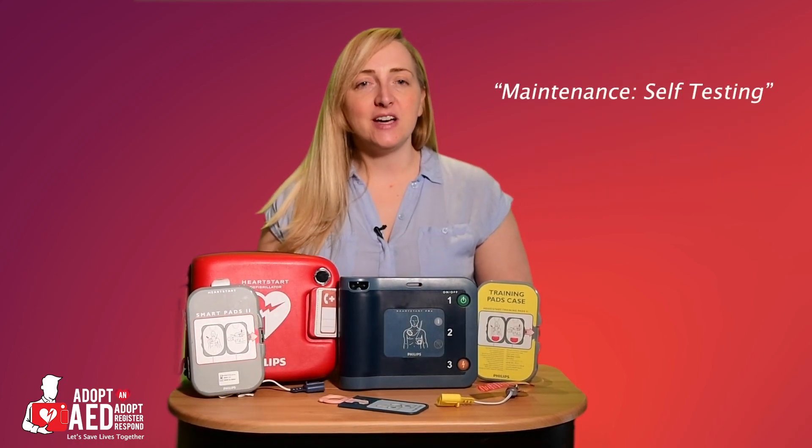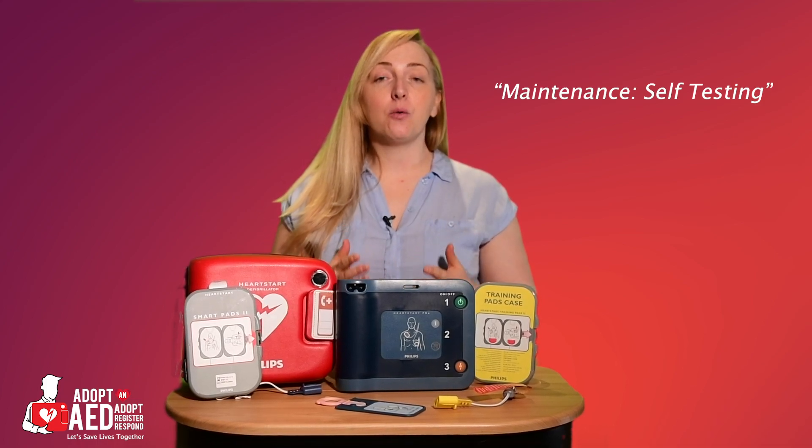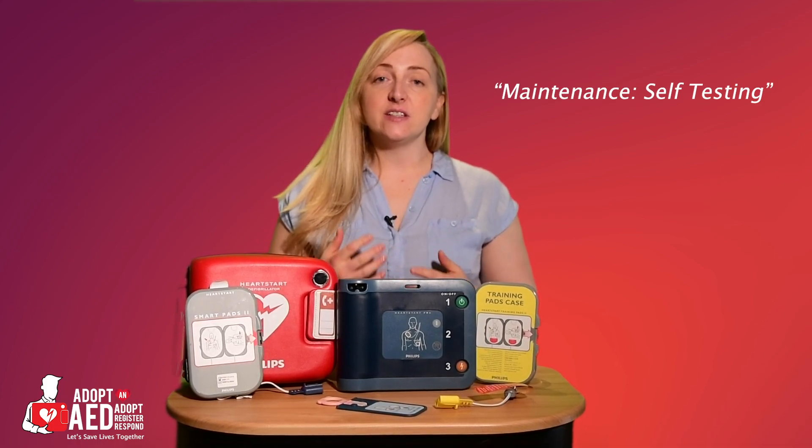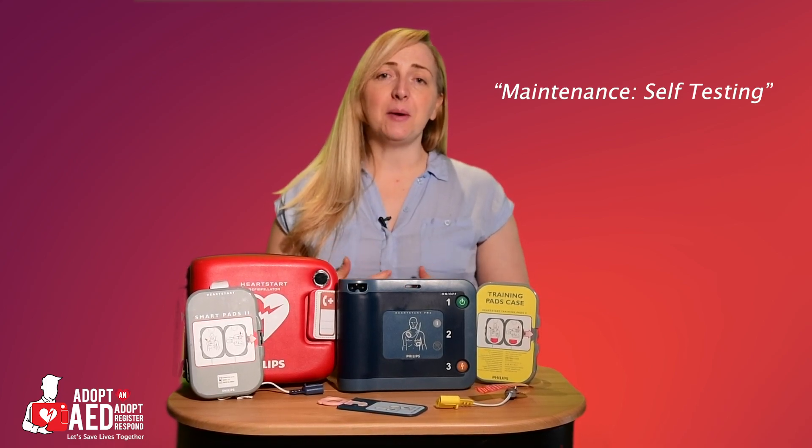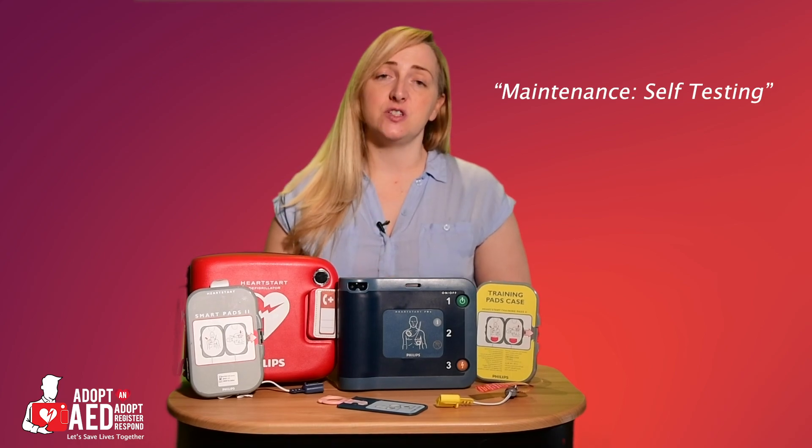The FRX conducts a series of automatic self-tests daily, weekly and monthly, and this includes the testing of the pads. It literally does everything for you, ensuring easy maintenance and a long life of the device.